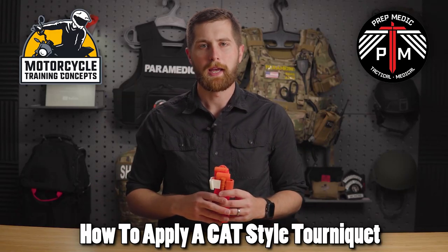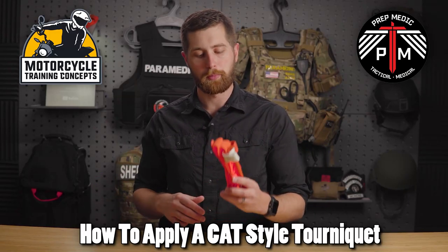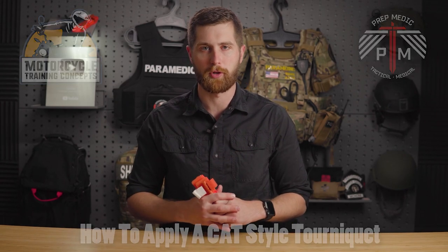My name is Sam from the YouTube channel PrepMedic, and in this video, I'm going to show you how to apply a CAT-style tourniquet to a severely bleeding extremity.